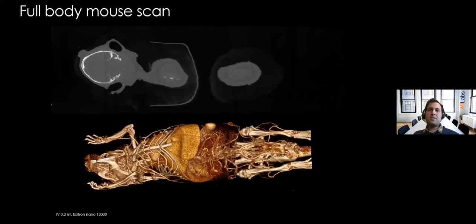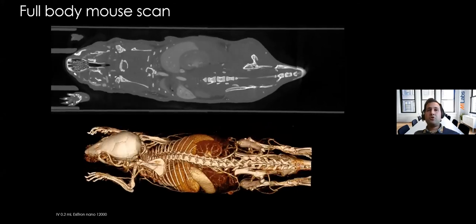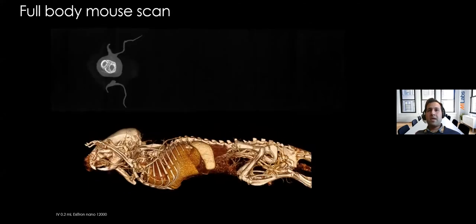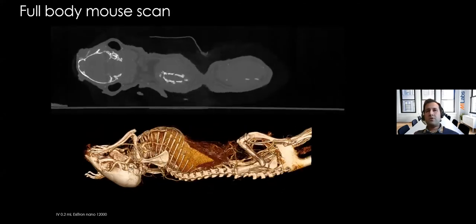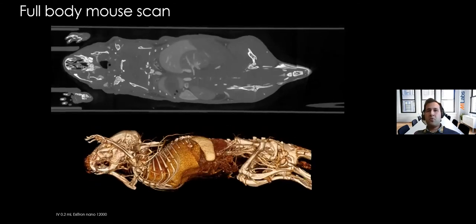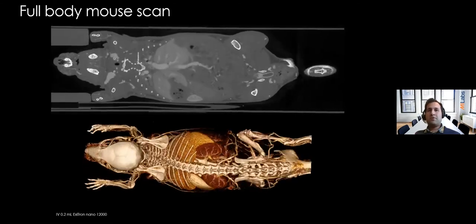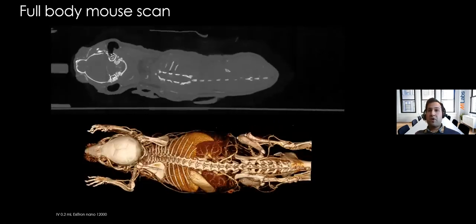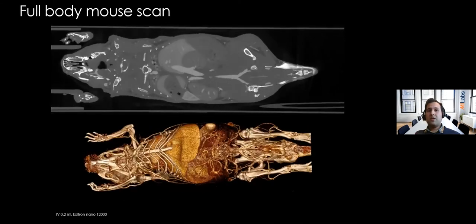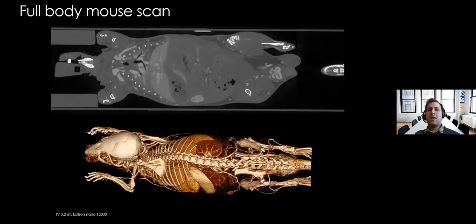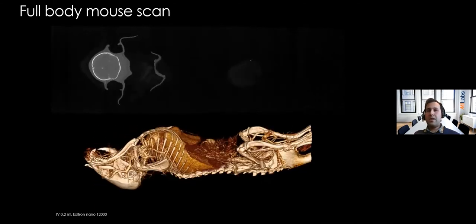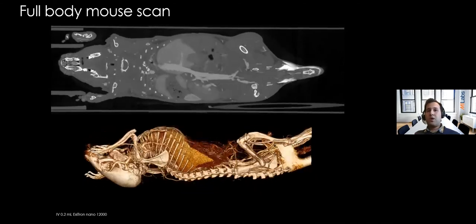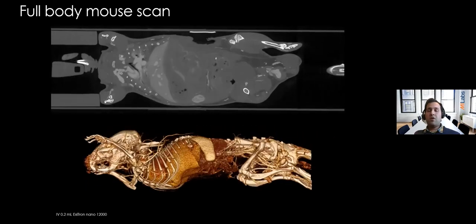So far I've shown some examples of parts of the body, but we can, of course, do full body imaging. In this example, we can see a full body mouse injected with a contrast agent — in this case, exitron — which has a high blood circulation time. We can see a lot of soft tissues like liver, heart, the vasculature, spleen, even the vasculature in the brain, as well as the vasculature in the bone. This is a very unique tool to allow us to study the full body of a mouse and later focus further on different parts of the body.